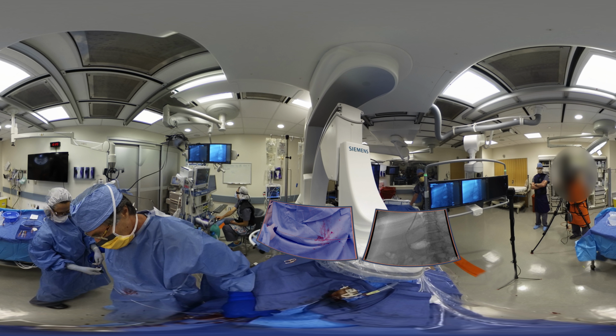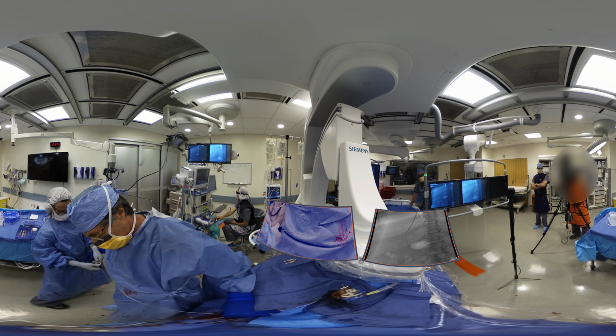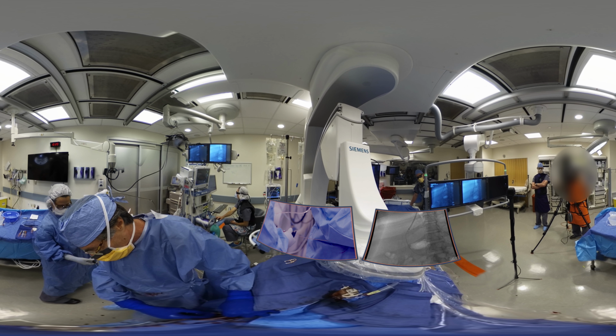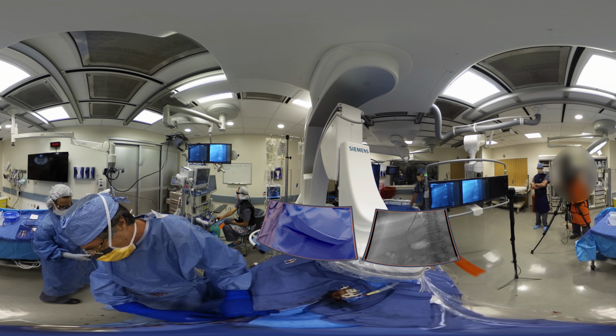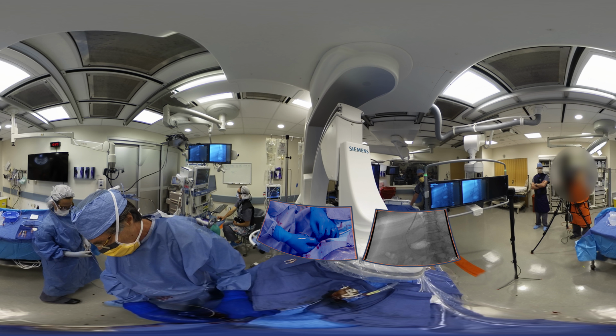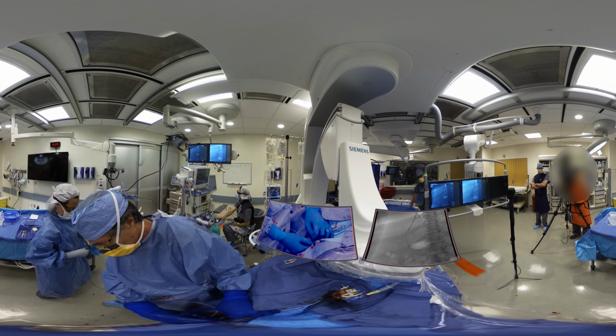You can feel the needle kind of exiting as its curve gets into the hub. The wire is released to you. And as soon as it comes out, I'm going to bend it against the hub and around my fingers. And I've got the wire. Yep, you can remove that in its entirety.